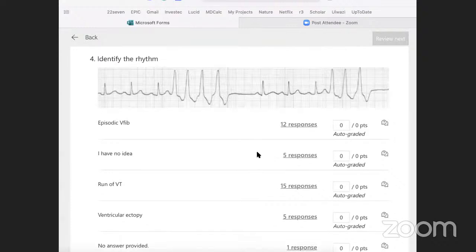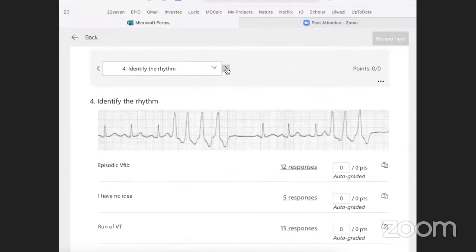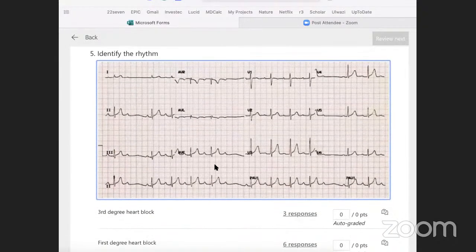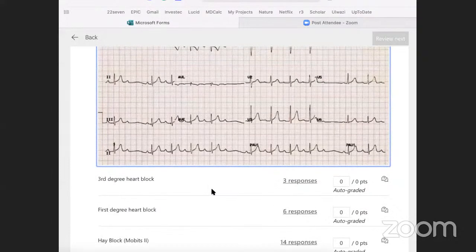Sorry, so afterwards, you're welcome to just discuss any of the ECG pictures if anyone has questions. So the rhythm here that we find: we have our P wave, P wave, P wave, P wave. And some people thought that this was a third degree heart block.